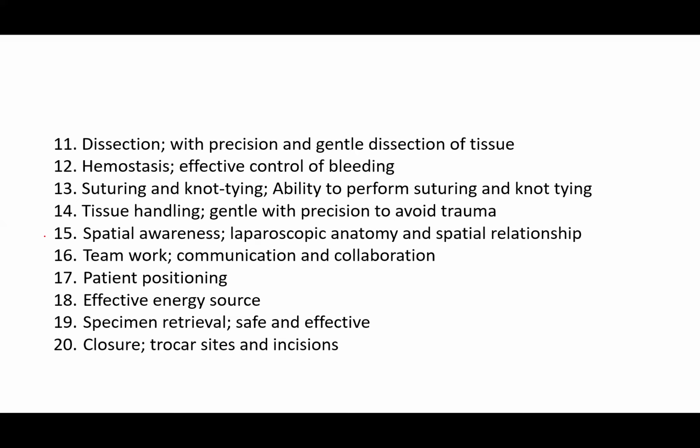Patients must be positioned properly depending on the type of procedure you are performing. Then effective energy source. You should have a very effective energy source, like your diathermy, your ligatures, your harmonic scalpel, and so on.